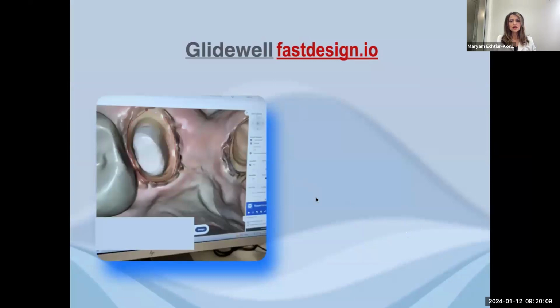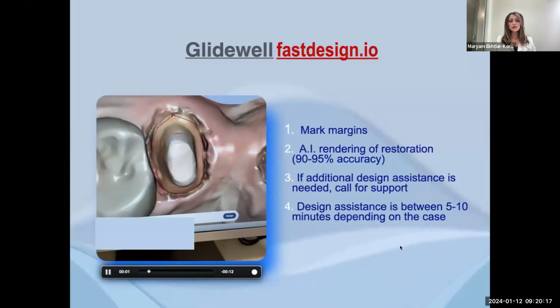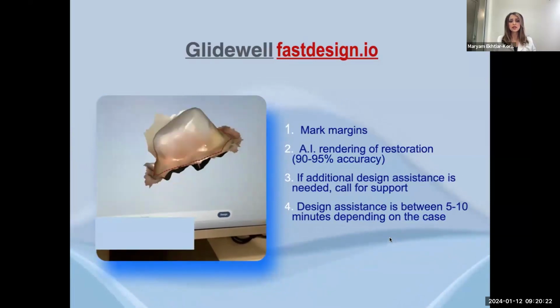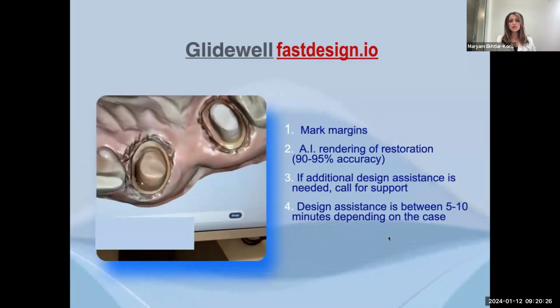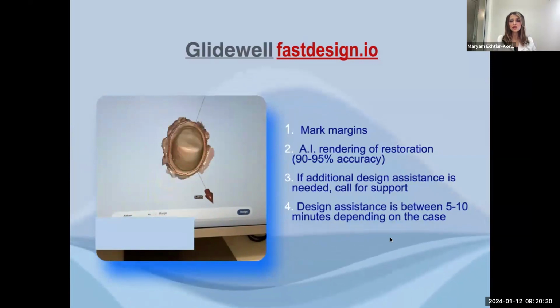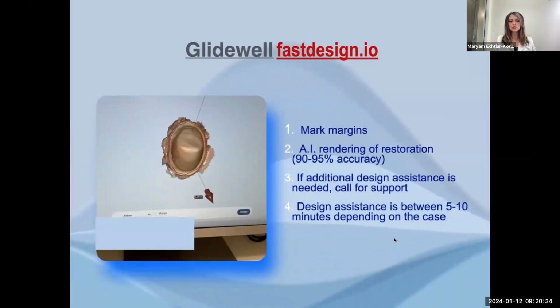From there, our scan goes to our fast design software, where I mark the margins. Now, this is not the previous inlay, of course. This is a bridge prep that I did, but you can see how easy it is to quickly mark the margins. And from there, the AI rendering of the restoration is absolutely phenomenal.